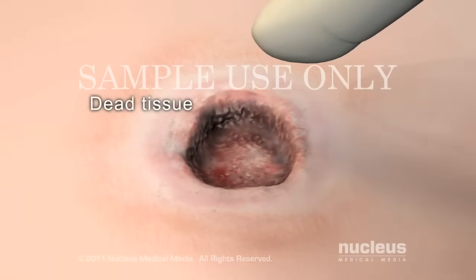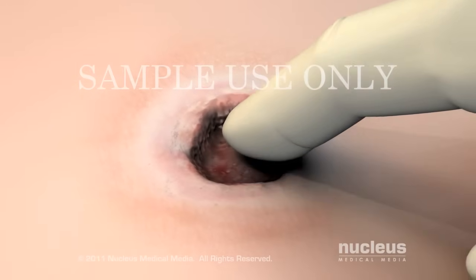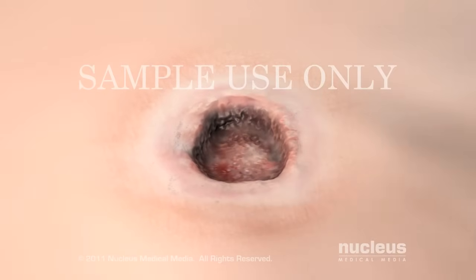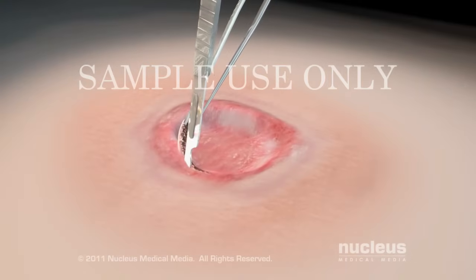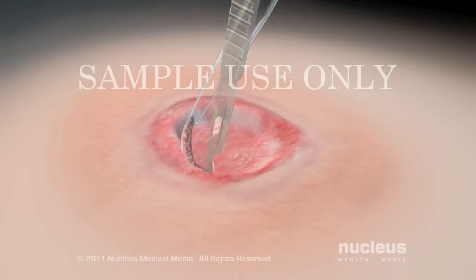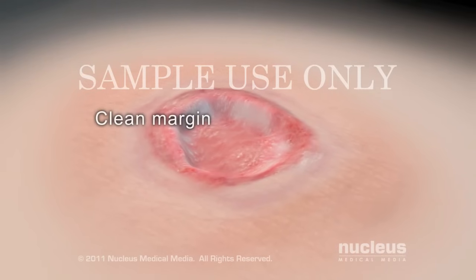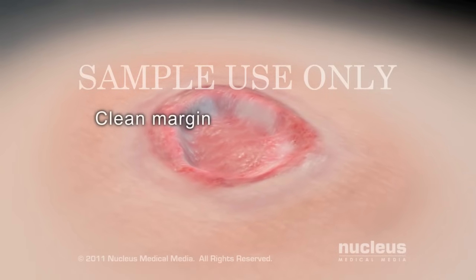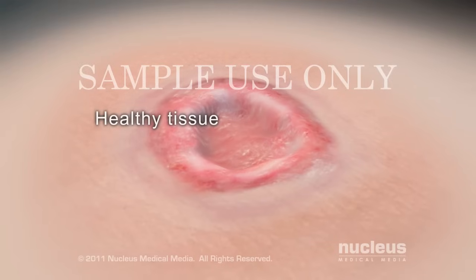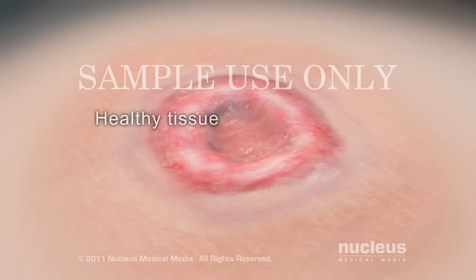Next, your doctor will evaluate the depth of your wound, checking the extent of the dead tissue. Your doctor may remove a rim of tissues from around your wound to create a clean margin of healthy tissue and improve healing.